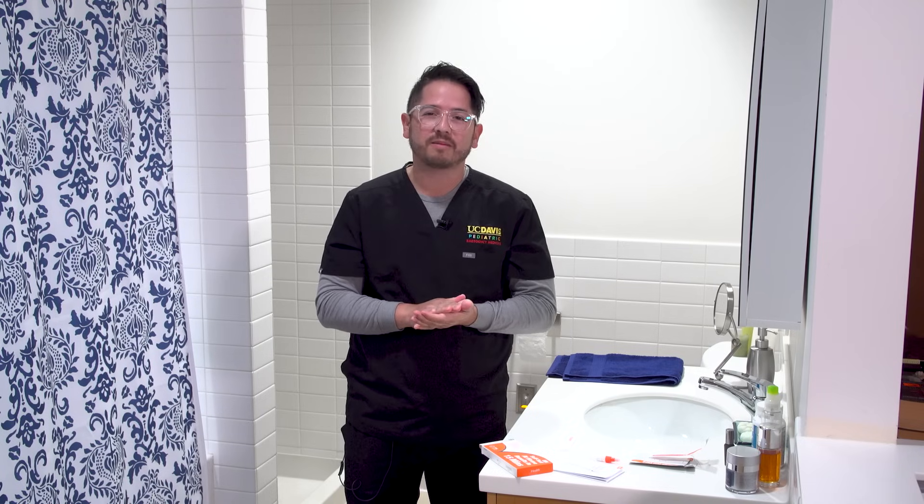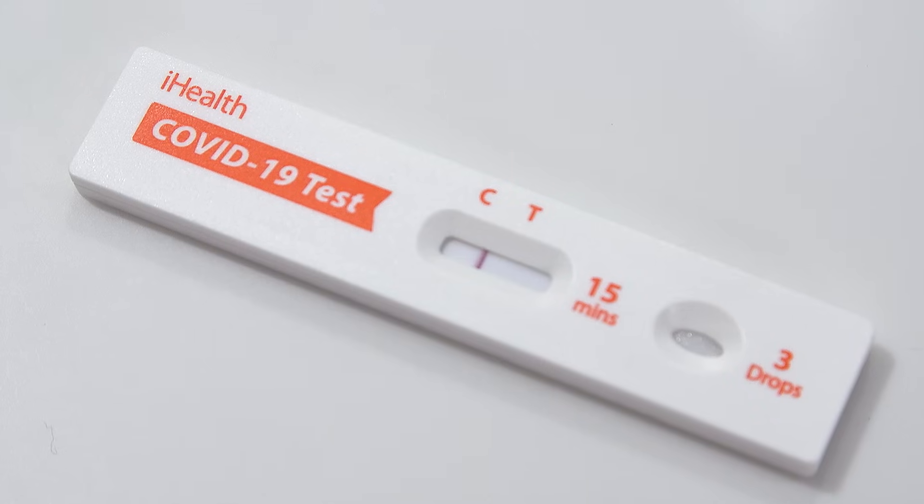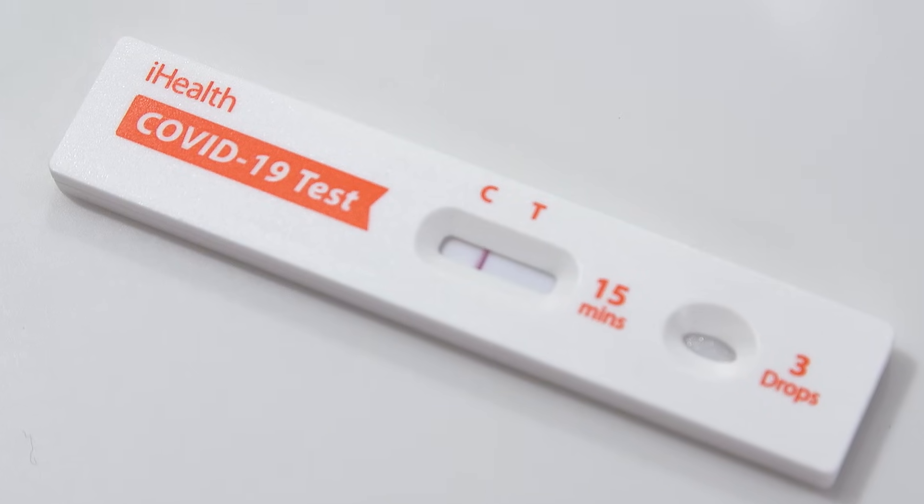Now comes the hardest part and that's waiting. The best thing to do is to set a timer on your phone for 15 minutes. After 15 minutes you can read your results. You'll look for one of two things. You'll look for a line at the C which is the control, and then if you are positive you'll see a line at the T which is your test results. Doesn't matter how faint or how bright the result is, but if you have that line at the T then your test is positive for COVID-19.